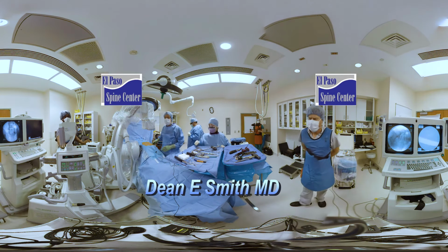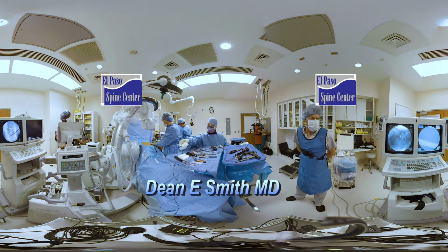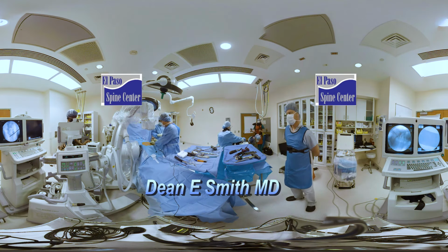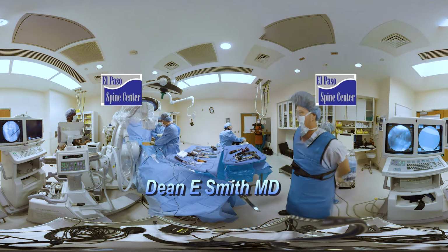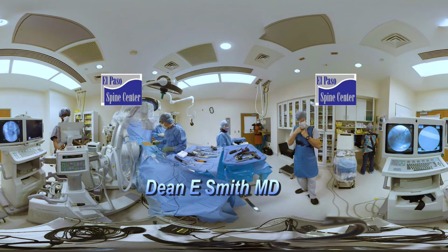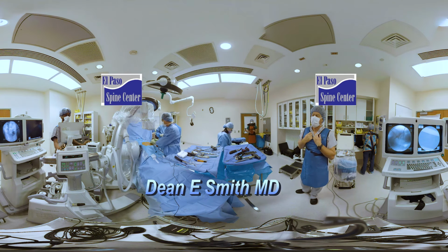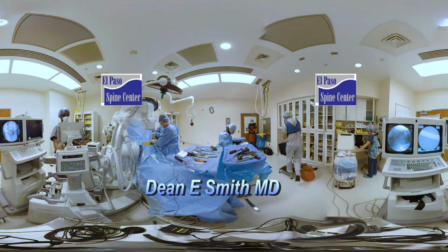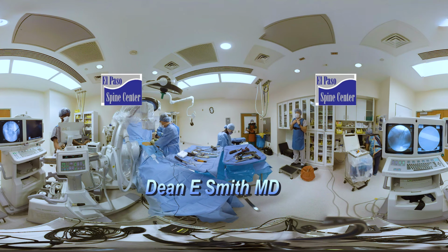AP, please. That looks pretty good. AP. Lateral. I'm going to readjust that a little bit. AP. AP, lateral. Lateral. That looks pretty good, AP.